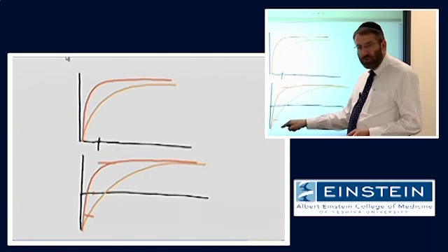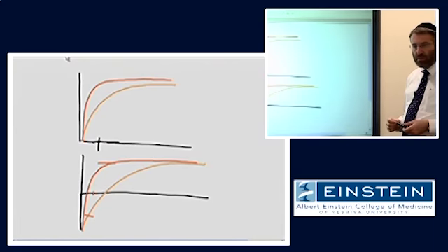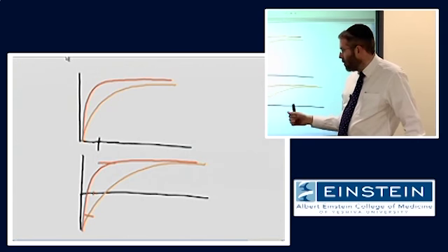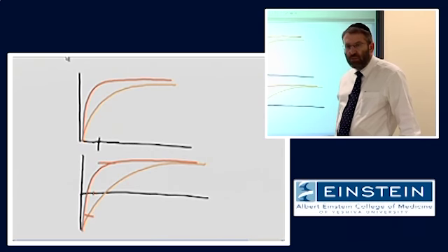There's going to be a much bigger difference between the longitudinal magnetization of those two. So you just stretched out the contrast in a way, emphasized the differences in the T1 contrast. We've made them more apparent. Right? So whenever you do inversion recovery imaging like this, you're always going to be enhancing the T1 contrast in your image. You could never get that contrast without that inversion recovery. Not that degree of contrast.